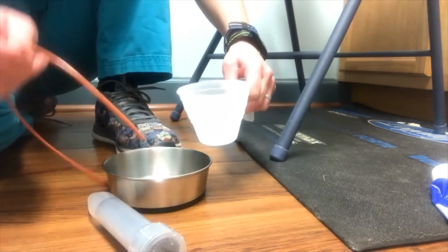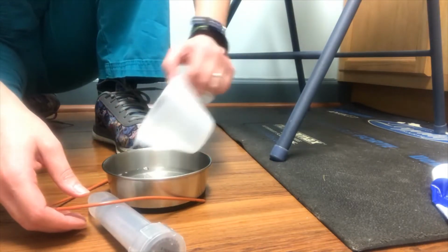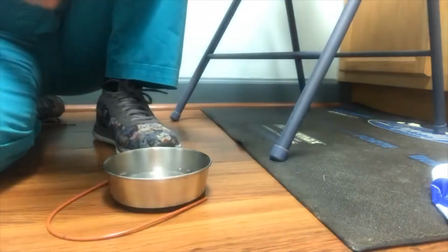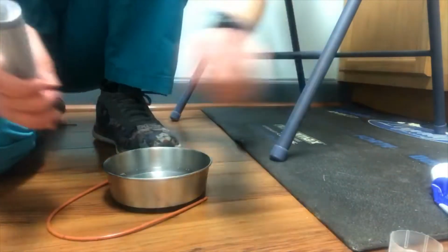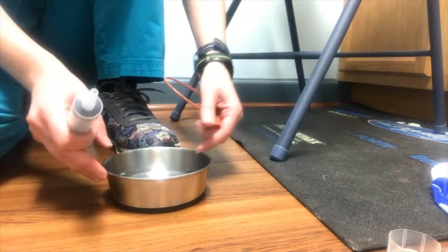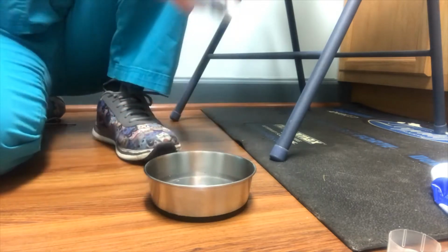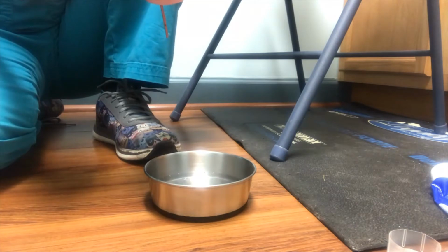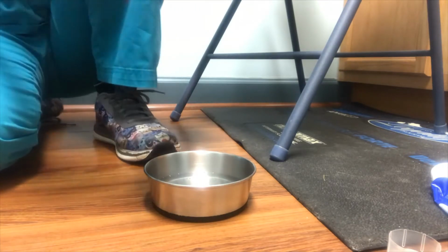Once it's mixed, I'll just put it in my bowl here. That way I have something easy to draw my mixture up into. Just a smidge more. So ideally, you would want to use about 5 to 10 milliliters per kilogram for your patient. Dozer here weighs 71 pounds, which would be about 32 kilograms. But for this demonstration, I'm just going to draw up a smaller amount.